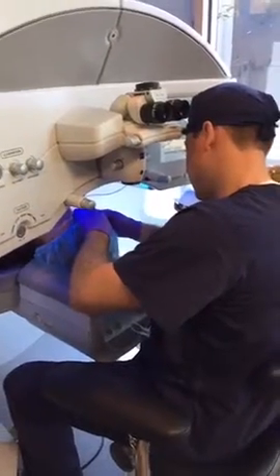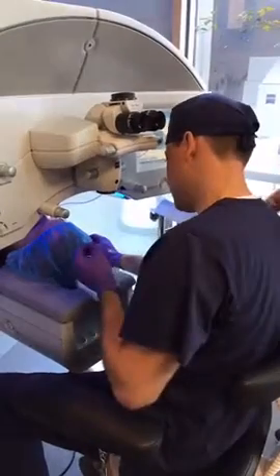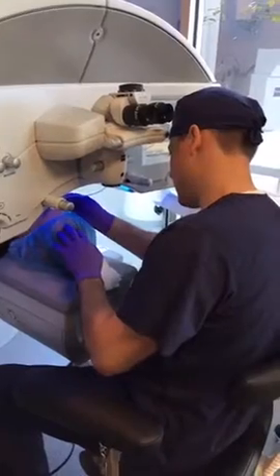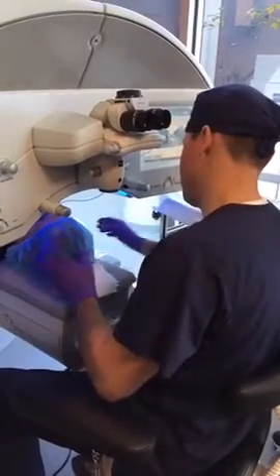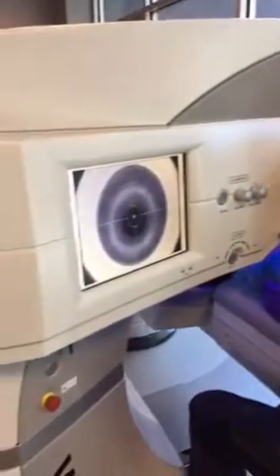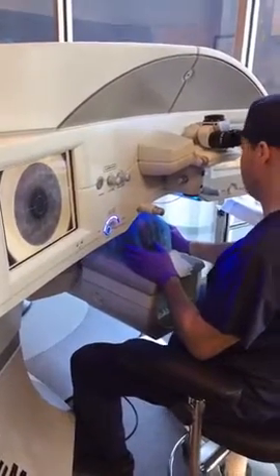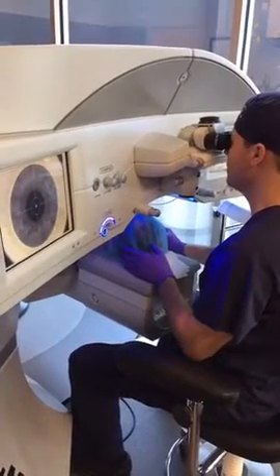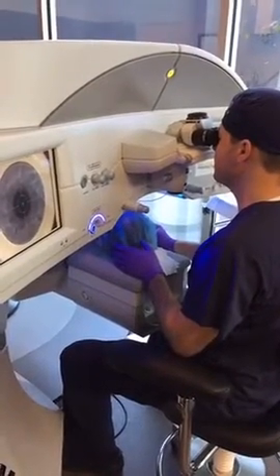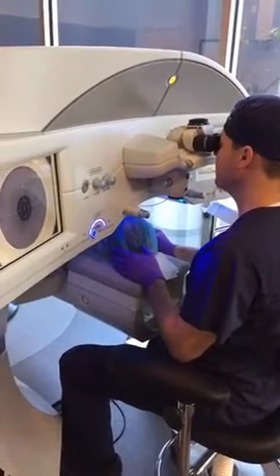You're doing great. Beautiful. Just watch that green light now. Do you see it? Perfect. Just continue to focus your attention exactly on that green light no matter what I do. Beautiful. Great job. Continue to watch the green light now. Looks great. Hold that spot there. Beautiful. That looks perfect. Just be real still now. You're doing awesome. Everything looks perfect. This step just takes a few seconds. Hold real still. You're doing great. Everything looks perfect. Green light will get a little fuzzy now, that's normal.